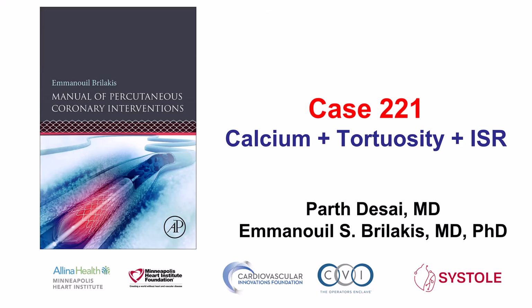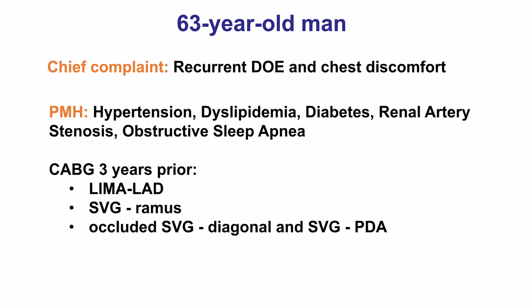Hi, this is Parth Desai and Manos Brilakis, and this is case 221 for the Manual of Percutaneous Coronary Interventions. This is a case that involved overcoming several challenges related to calcification, tortuosity, and in-stent restenosis.